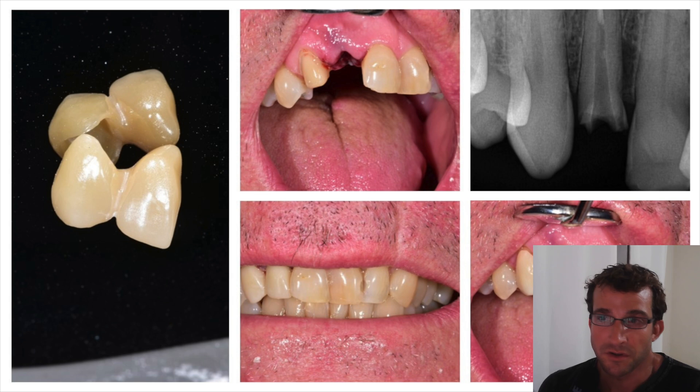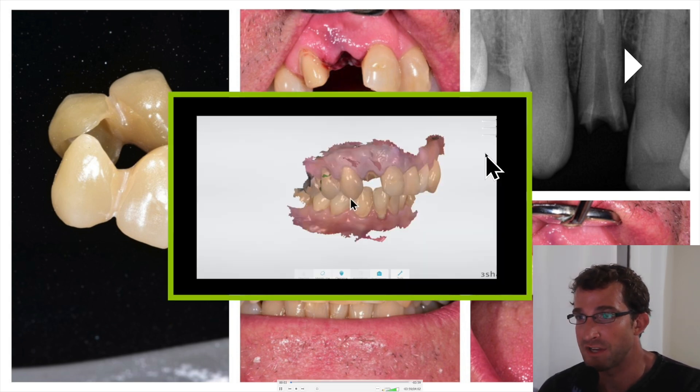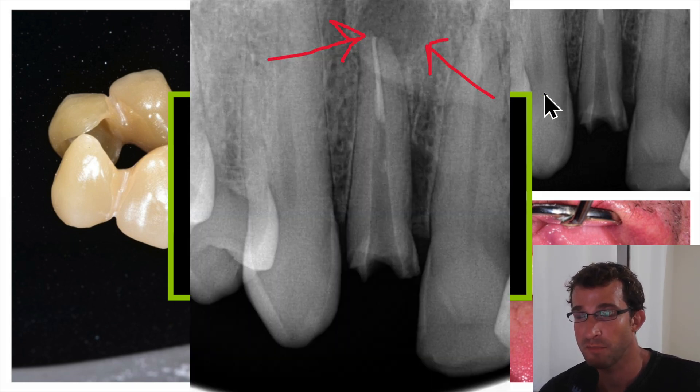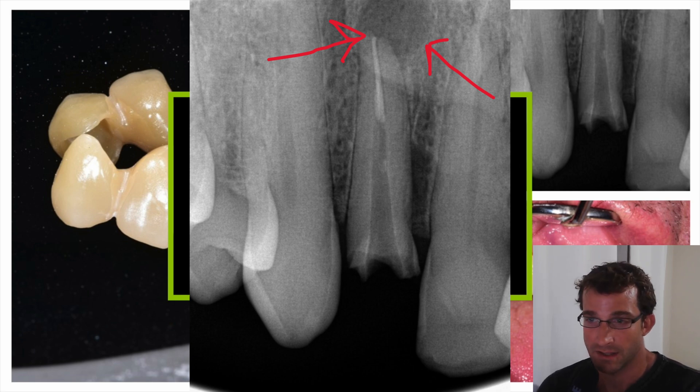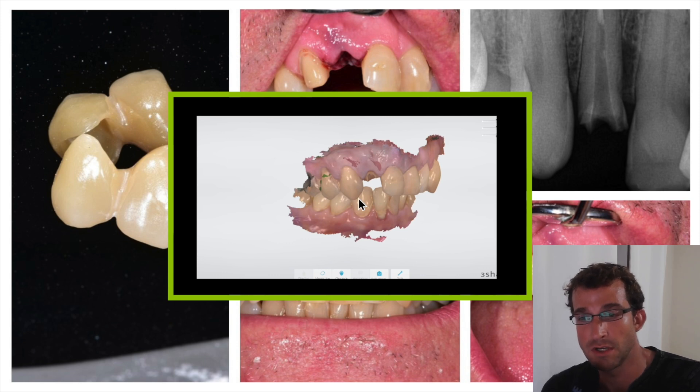Dr. Dobson here. We're going to be doing a 1-2 cantilever bridge in this case. This is a patient that fractured their 1-2. The tooth had a root canal and a post, and actually quite a large infective lesion at the apex. Here's an x-ray. They presented saying they're missing a front tooth and want it back as soon as possible. Options include an immediate implant, which I'm generally not comfortable with — especially an immediate loading implant, especially if there's a lesion.